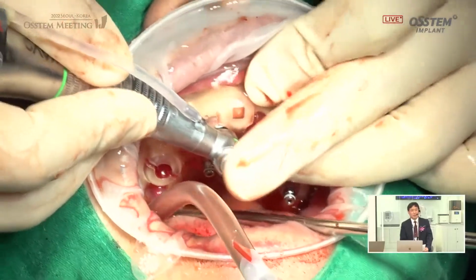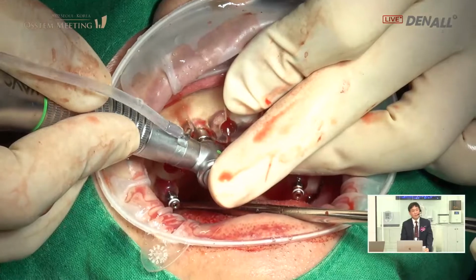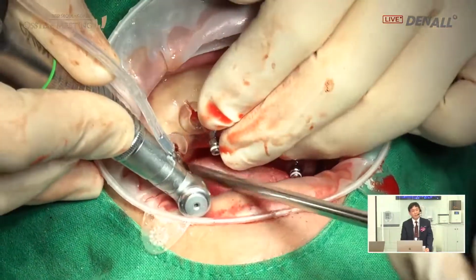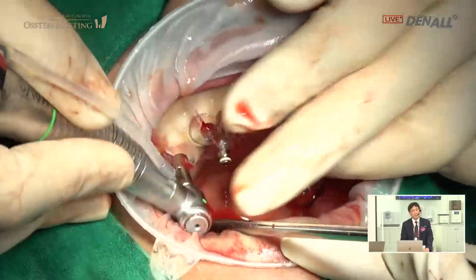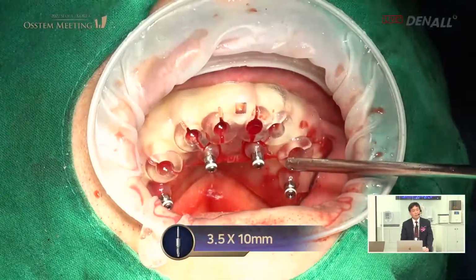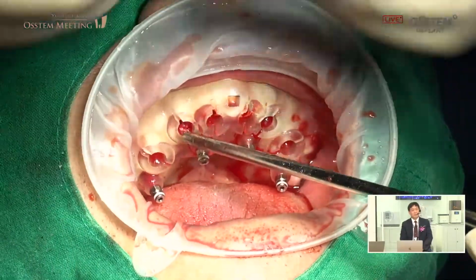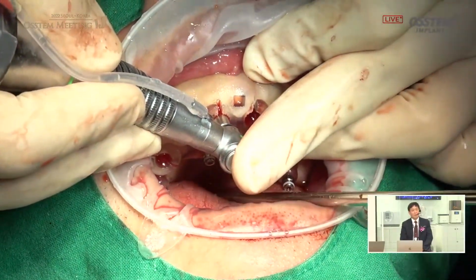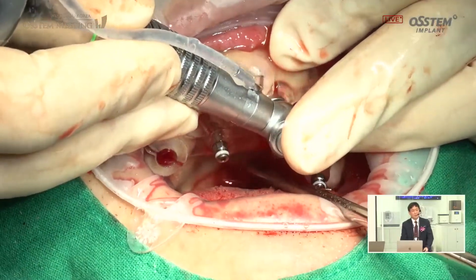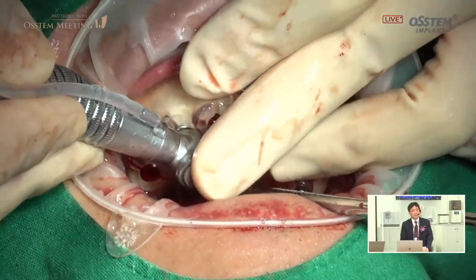The drill that you're using, what is the length? 3.5 wide, 7. In doing drilling, a 3.5 by 8.5 implant is designed. I think we need more anesthetics.